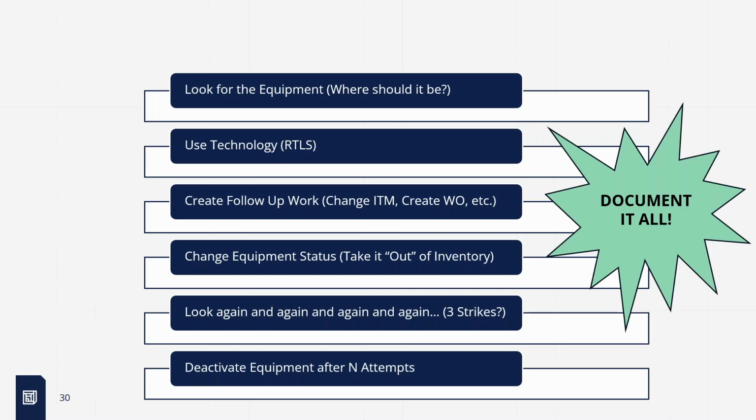Like, oh, I've got to enter all these assets, or this group of people's assets. Yep. But two or three years down the road, you're going to have a huge mess, especially with the dates and departments and who owns it. Like I said, that list on the inventory slide of what you're tracking, you need to be anal about it, for lack of a better term, if you really want to report and track this stuff properly. So those are just some brief strategies around that inventory part.